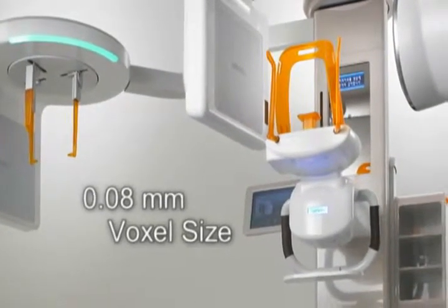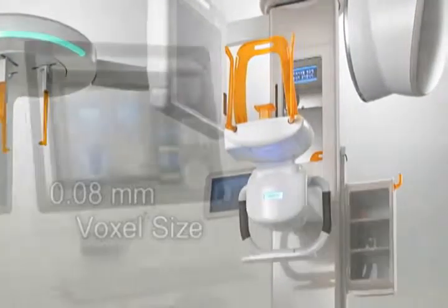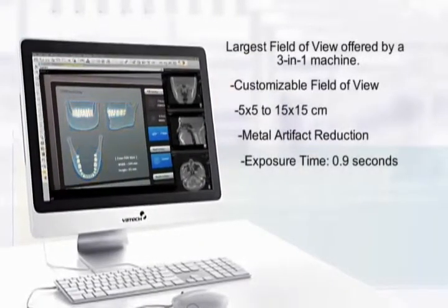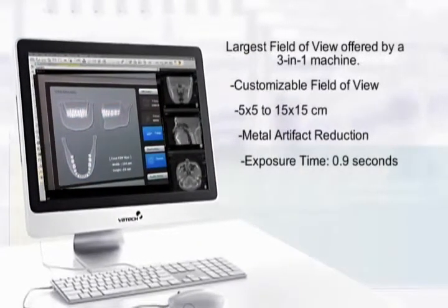In fact, Vatech was the first to offer this feature. To date, the Pax Reve 3D has the largest field of view offered by a three-in-one machine.